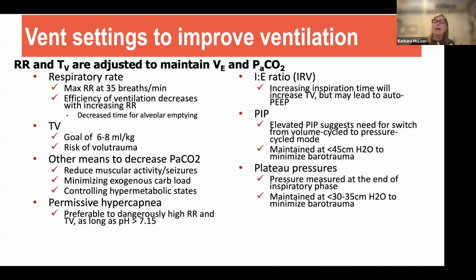Sometimes, in order to protect the lung and to try to open the derecruited alveoli, we may choose an ultra-low tidal volume. And if we're not using a methodology that allows us to have a higher rate, we may actually say, I understand that in this situation, I'm going to allow my patient to retain CO2. That's preferable to an over-distension of the alveoli, which then, of course, will promote ARDS, and also is better than having a dangerously high respiratory rate, anything greater than 35.